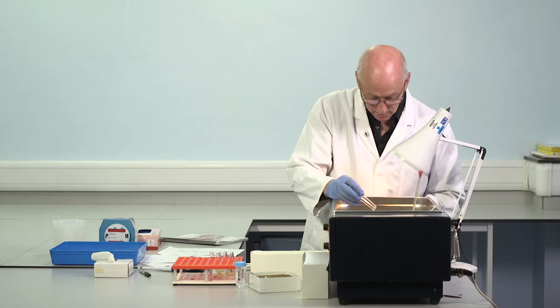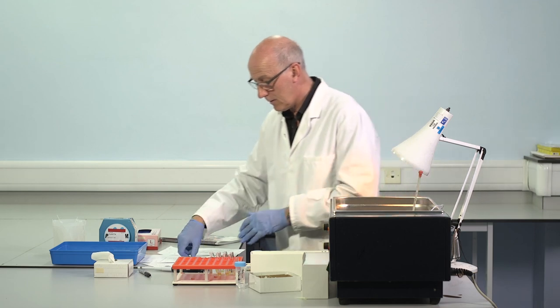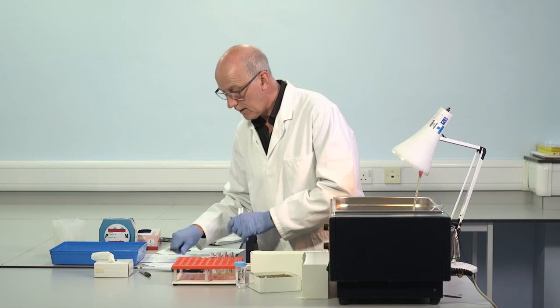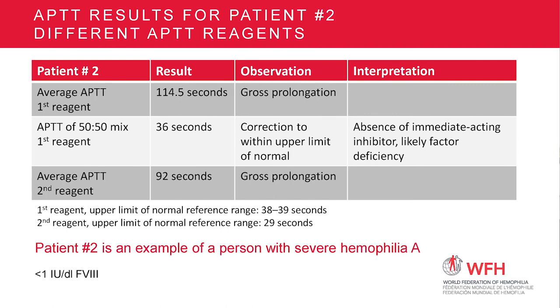Grossly prolonged. 93 seconds, 91. Grossly prolonged with both reagents. Suggestive of a pretty marked deficiency. Very good correction, also suggestive of a marked deficiency. This patient has severe haemophilia A.